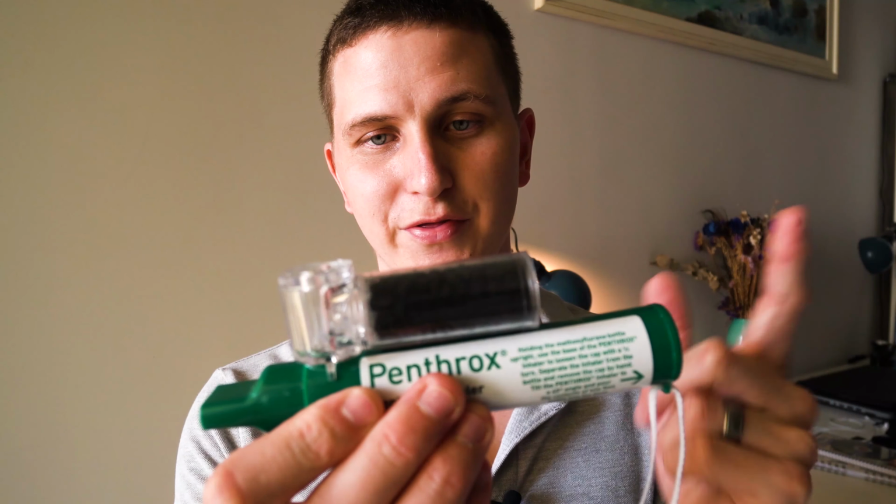There's a way to increase the strength of the whistle, which is to put your finger at the top. Normally when they breathe in, air goes in the back and in the top. If you block this, you're not getting any ambient air with no drug, you're only getting drug.